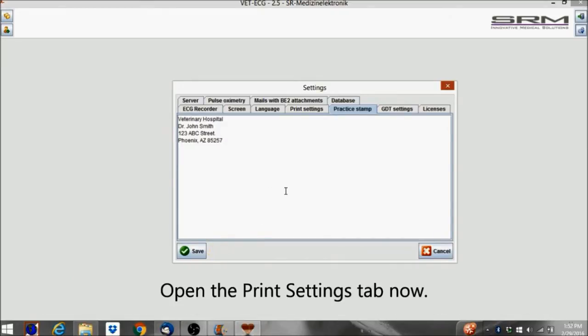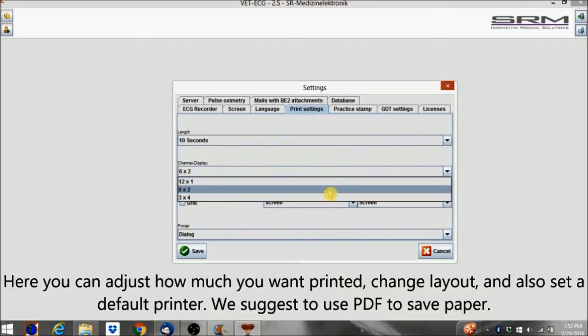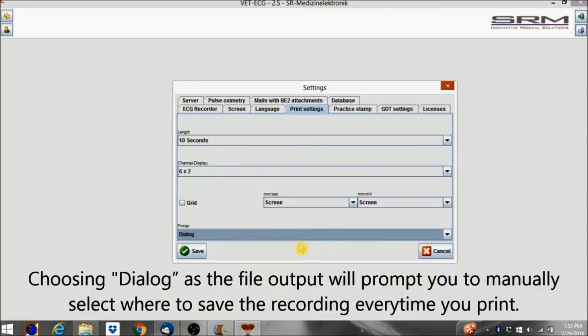Open the Print Settings tab now. Here you can adjust how much you want printed, change layout, and also set a default printer. We suggest using PDF to save paper. Choosing Dialog as the file output will prompt you to manually select where to save the recording every time you print.